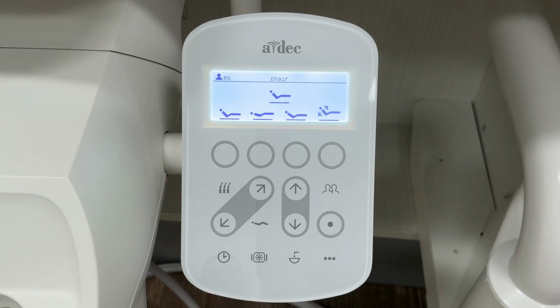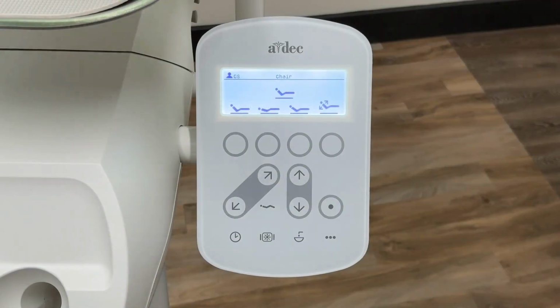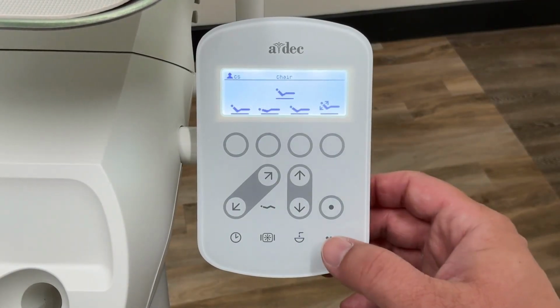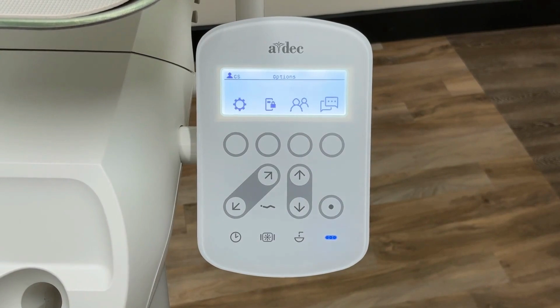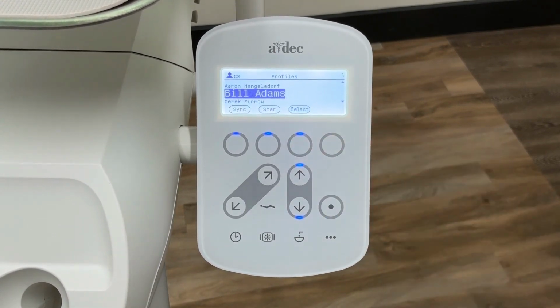On a CP5i, begin by pressing the user button. On a CP5, press the Options menu button. Then select Multi-User. Use the up and down arrows, then press Select to choose your desired profile. A check mark will appear to the right of the name indicating the profile has been selected.